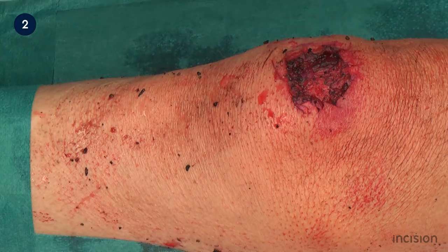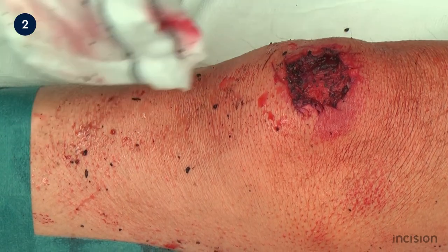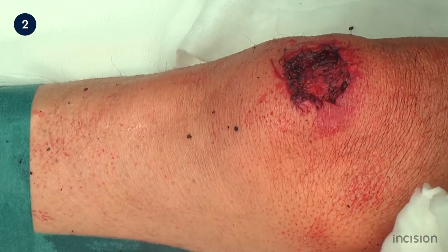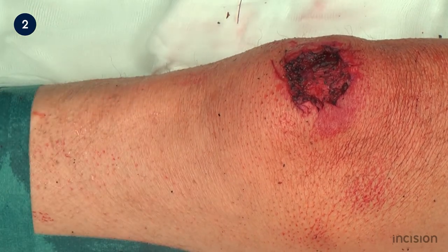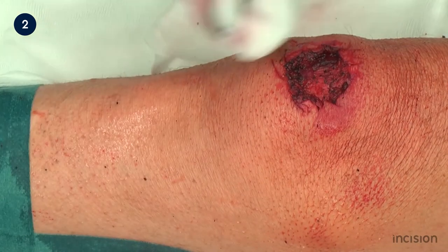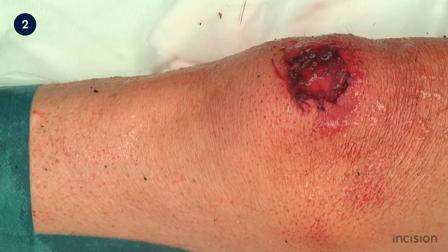After cleaning and preparation for debridement, the wound and surrounding tissues are then carefully inspected, looking specifically at the quality of the soft tissue and margins of the injury, areas of devitalised tissue, the transition from healthy to non-vital tissue and the colour and nature of the wound bed. Assessment is made on the quality of tissue perfusion within and surrounding the wound. In cases of delayed debridement, signs of infection are also inspected for.